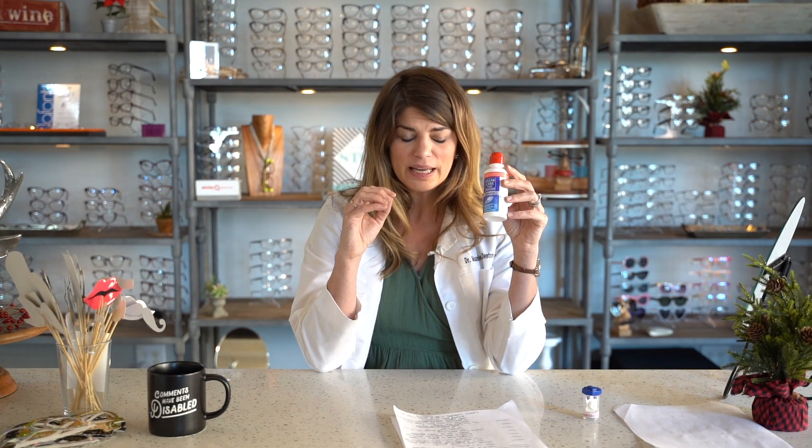Hydrogen peroxide is going to give you a deeper clean than a multipurpose disinfecting solution. This is a 3% hydrogen peroxide solution. Clear Care has about 80% of the market share at this point. There are other hydrogen peroxide solutions out there, but this is the market dominator for sure. This also has Hydro Glide in it, which is a surfactant lubricant. If your eyes do well with that, great — if not, you need to look for the other 20% of market share, because they don't have surfactant. It makes the eyes more comfortable.